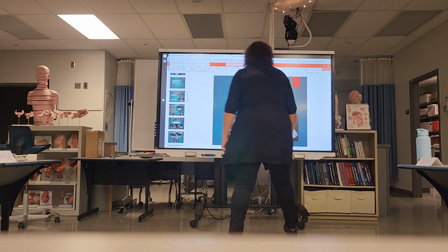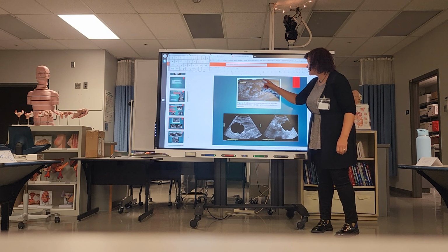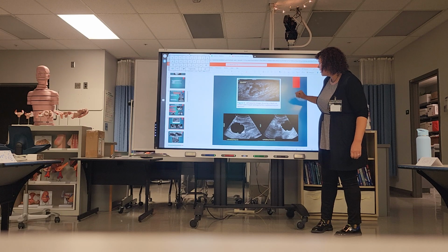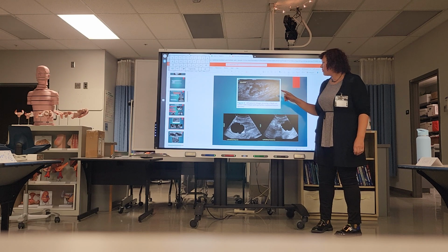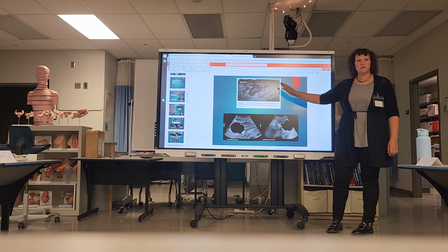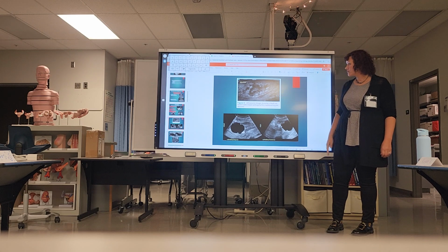Okay, some more border work. Right here we have an abscess. I can see this heterogeneous area here, but where does it start? Where does it end? It's really hard to tell. For these borders, how would you describe this? Irregular, ill-defined, poorly circumscribed, yeah.